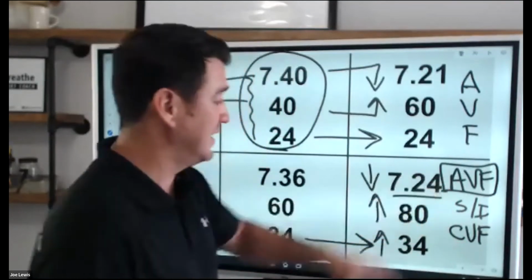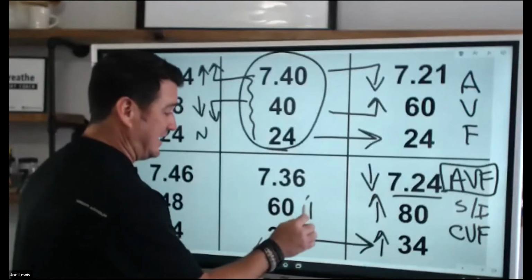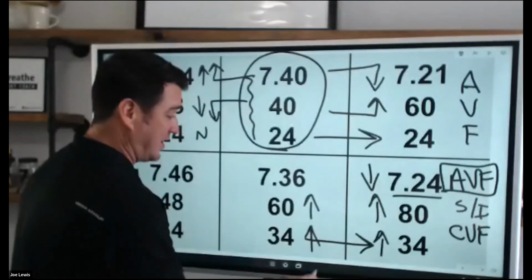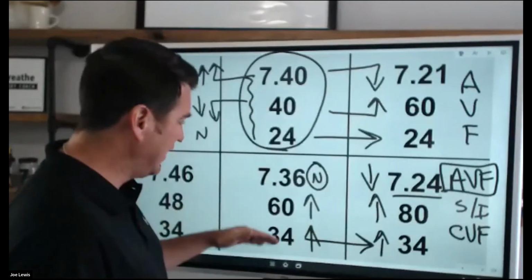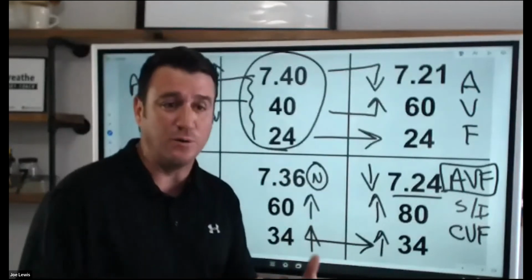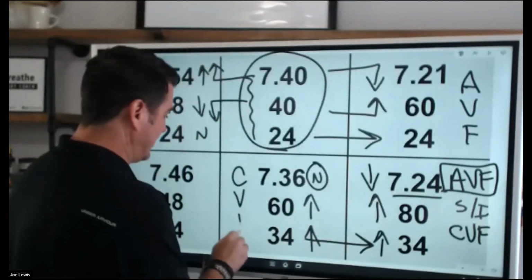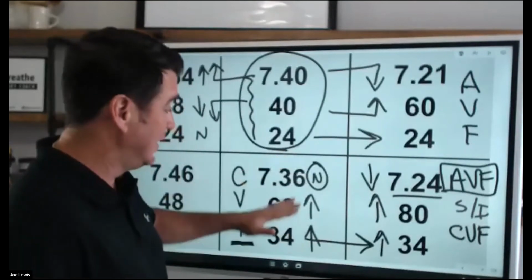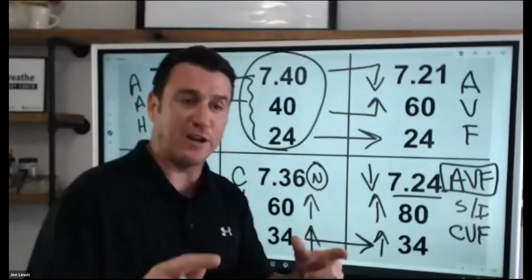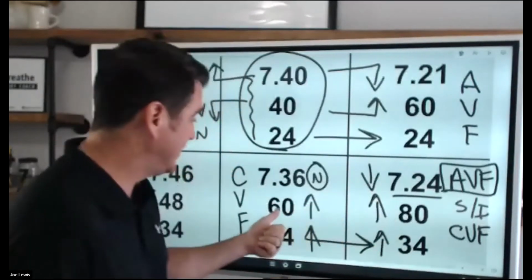So this is interesting. So keep that in mind. Now over here, we see high CO2, we see elevated bicarb, we see normal pH. Well, okay, this is fully compensated respiratory acidosis. This person lives here, again, chronic ventilatory failure. This is their normal. This person probably does not need your intervention in terms of trying to help them get rid of this CO2.